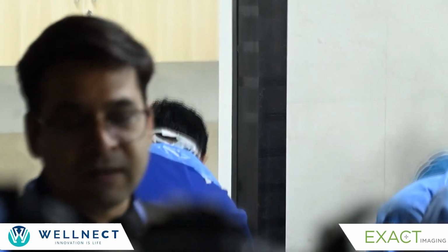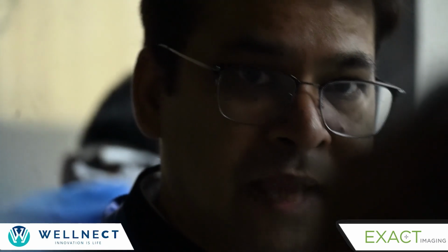So I think now we will basically be discussing transrectal anatomy with a 29 megahertz ExactVu.